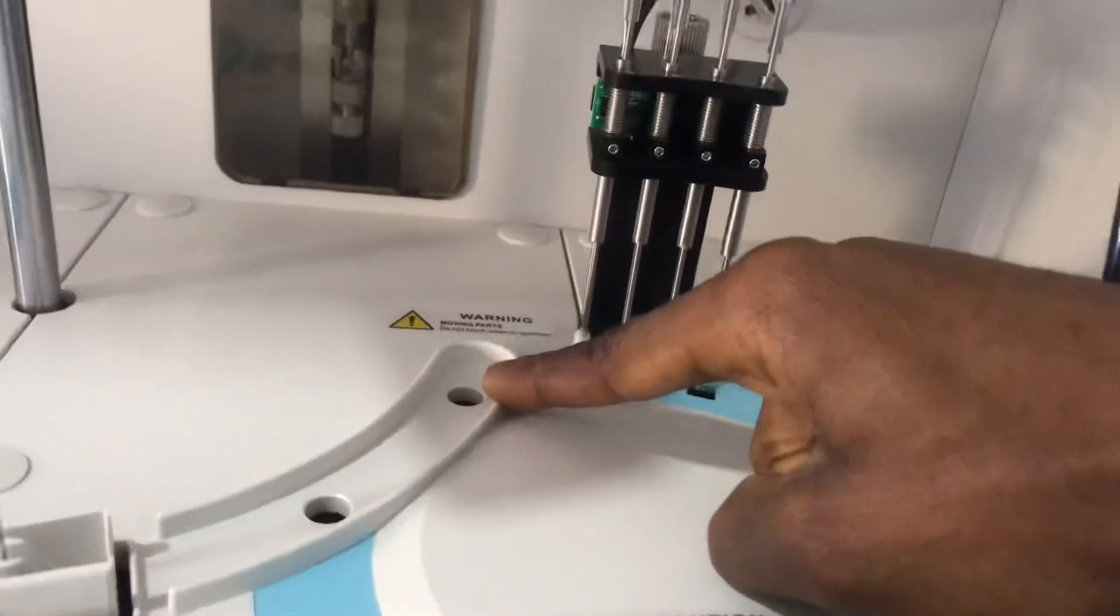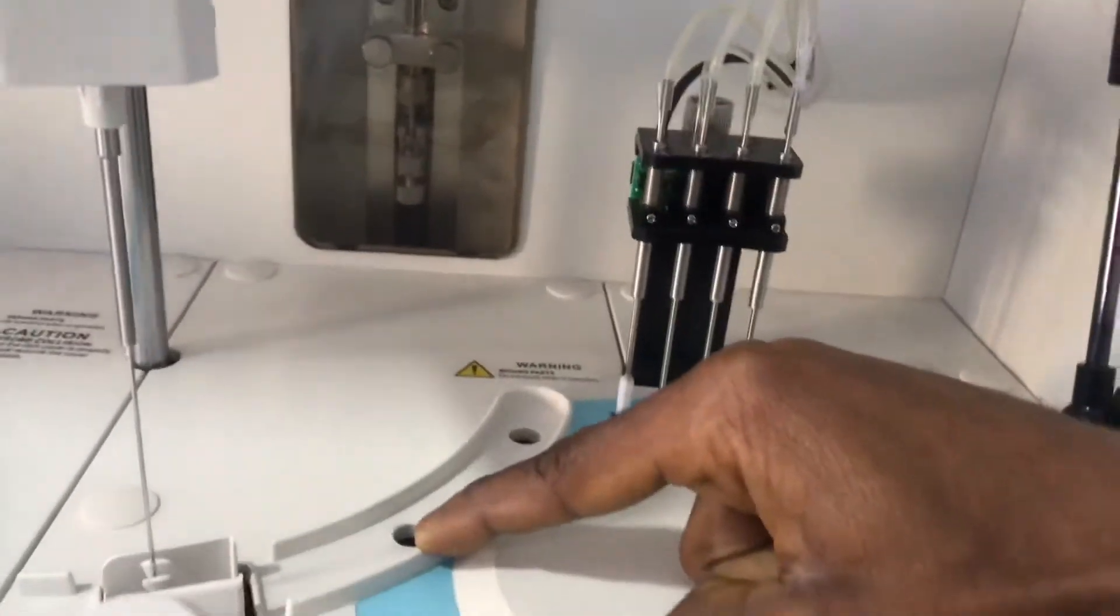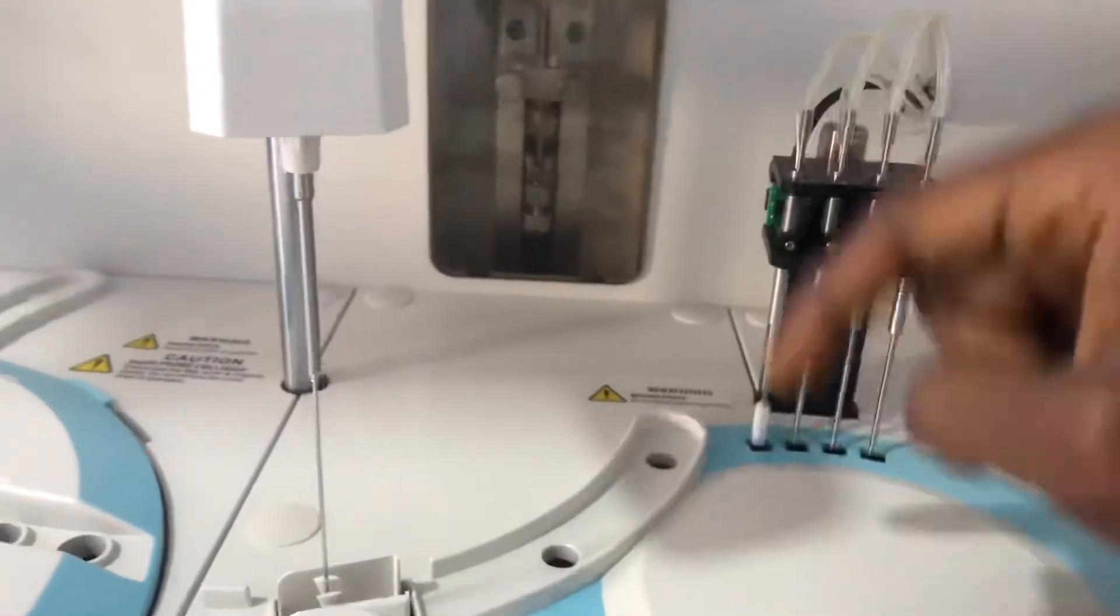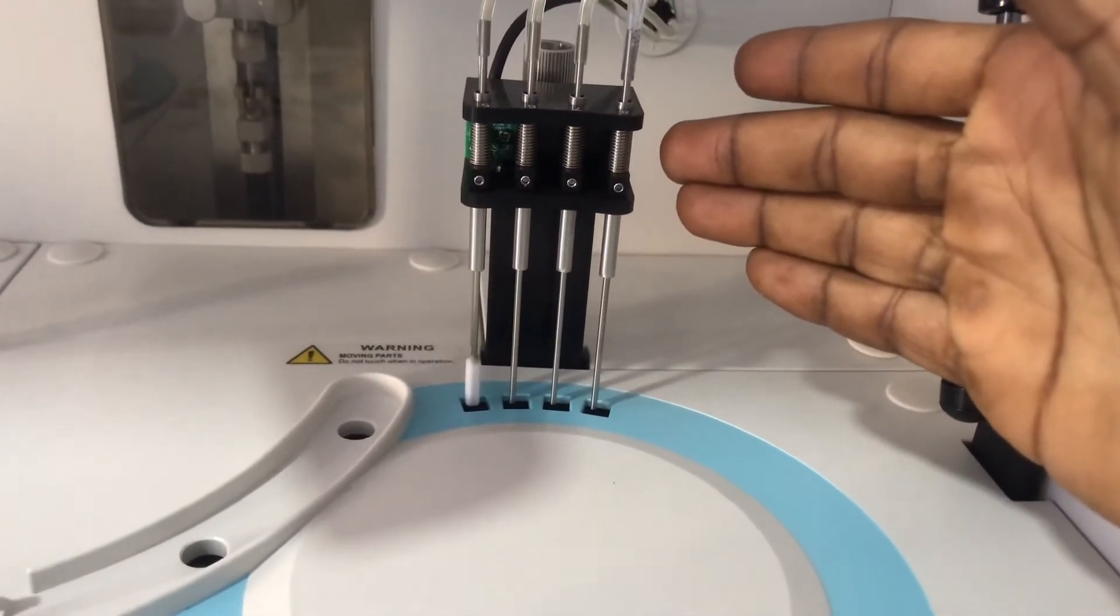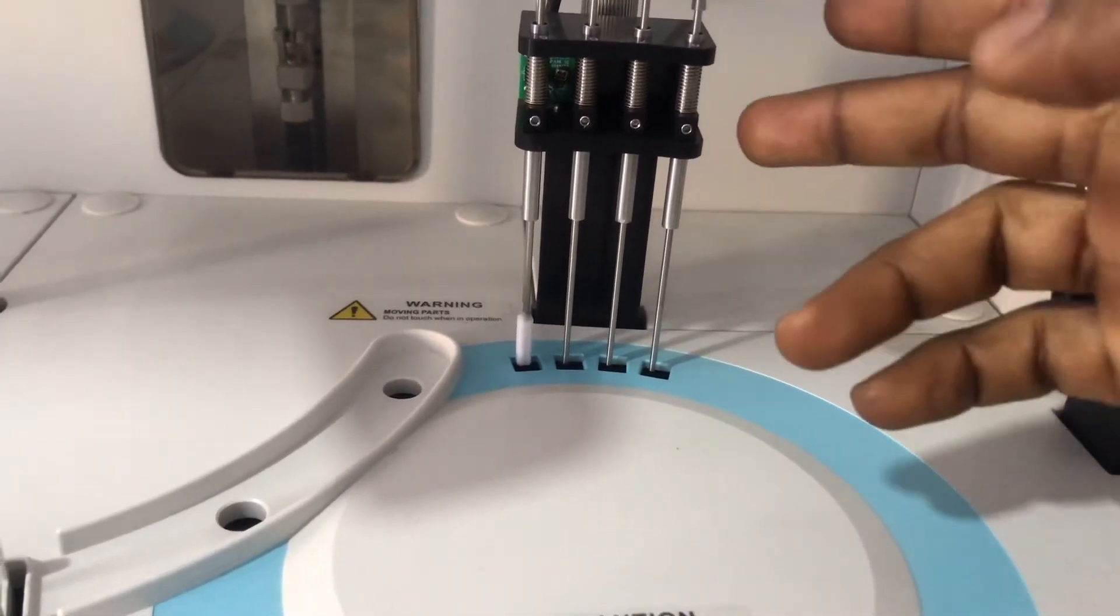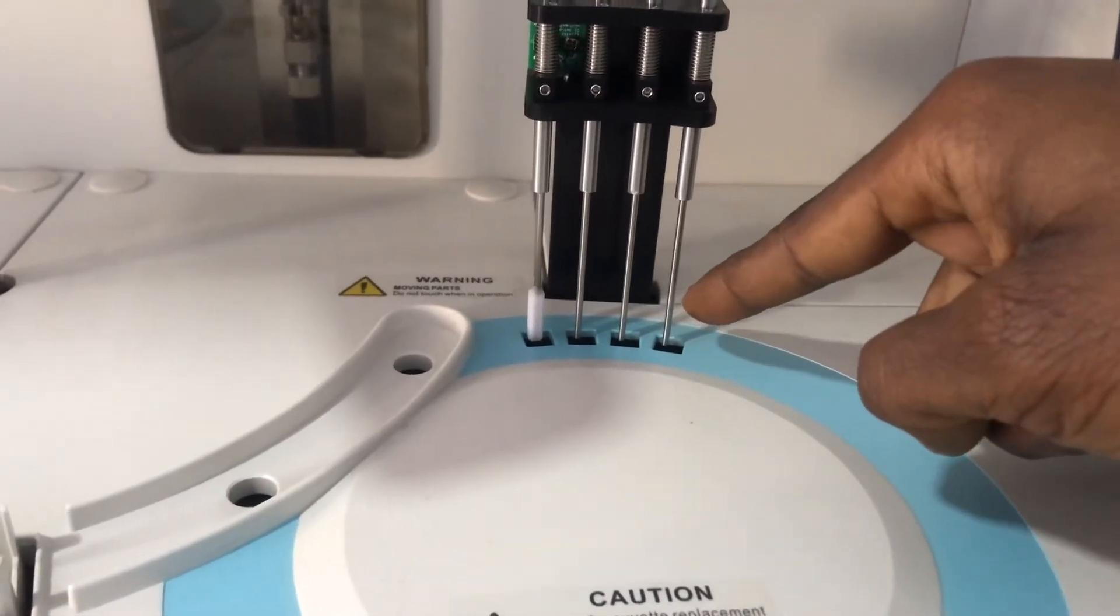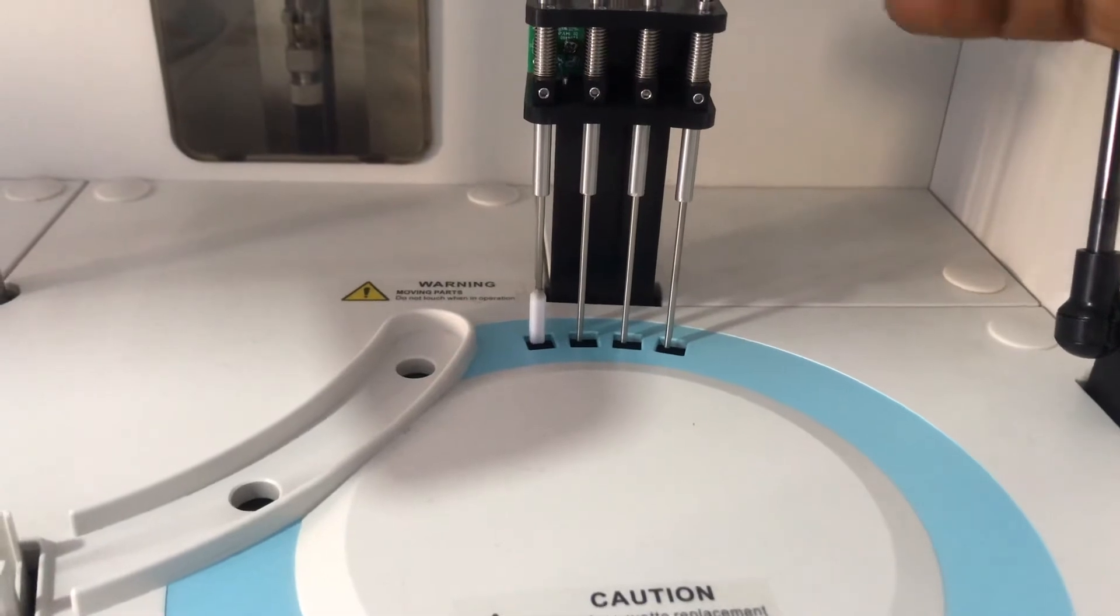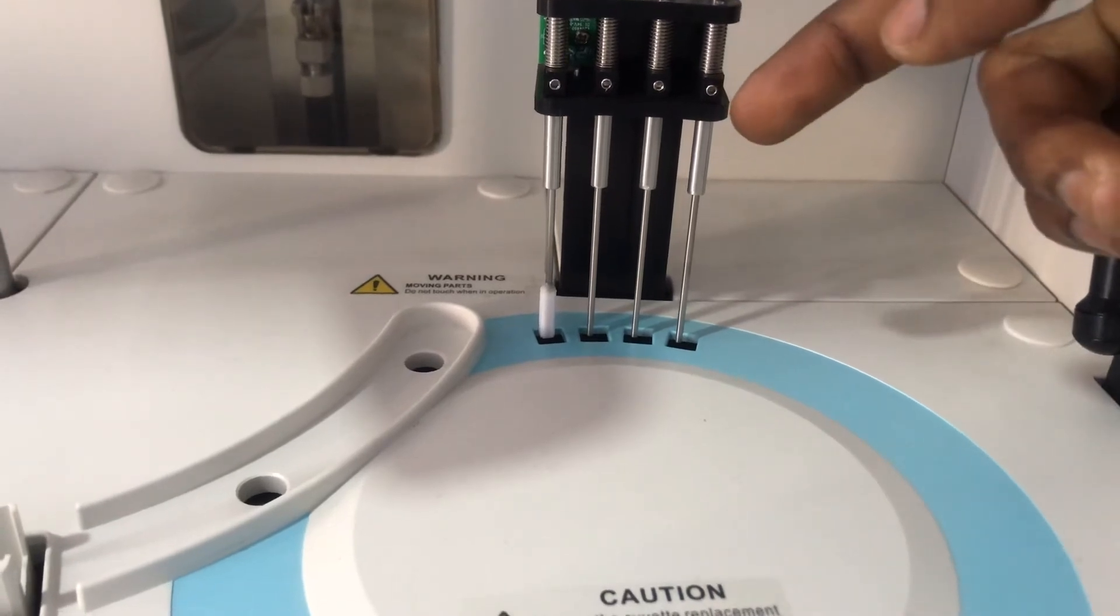There's an R1 dispense position where reagent one is dispensed, and this R2 dispense position where reagent two and the sample is dispensed by the dispenser. Here we have the eight-phase wash that the BS-240 supplies. These probes are connected to the fluids and help to wash the cuvette, and this one does the wiping.